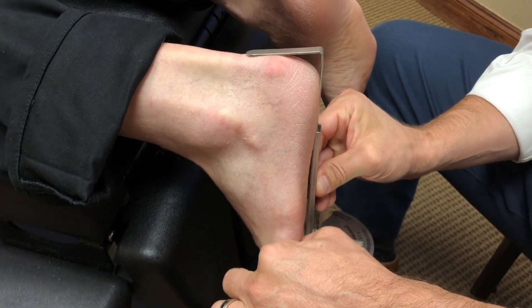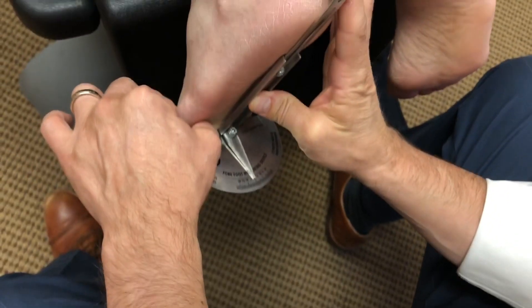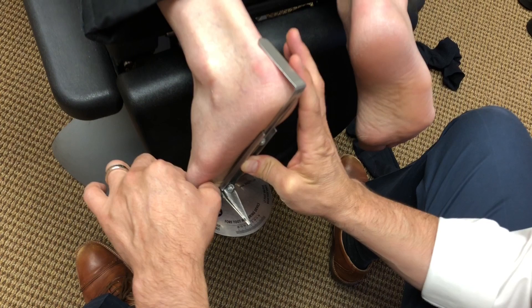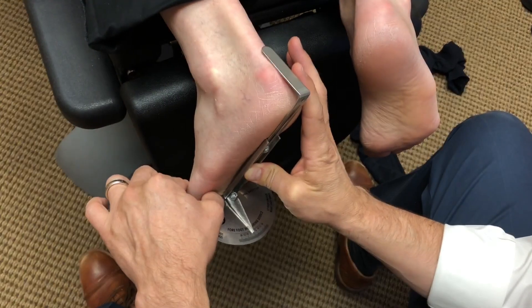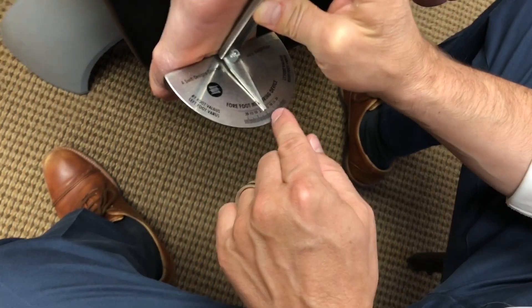You can see the platform is now underneath my left thumb. This vertical upright portion is in line with that of the Achilles. Now I'm going to look down and look at the measurement here, and you'll see that it's a zero.